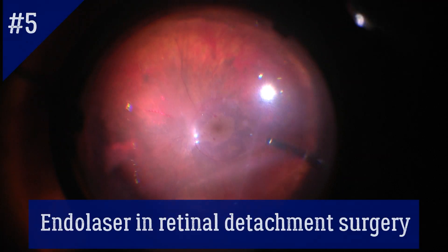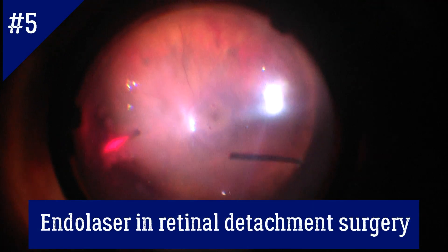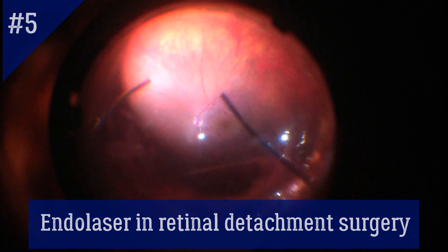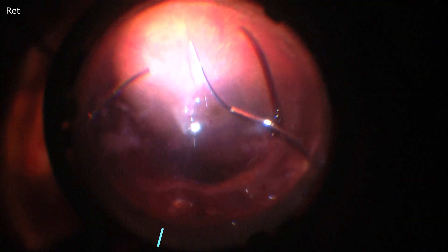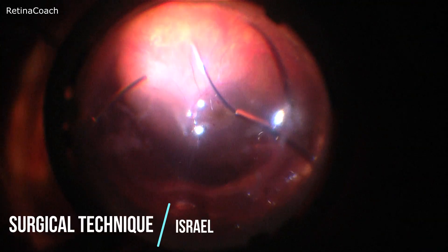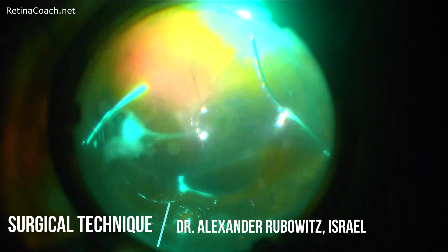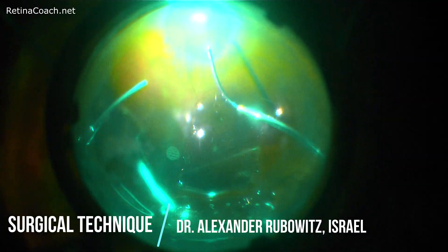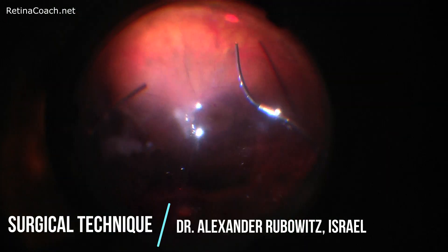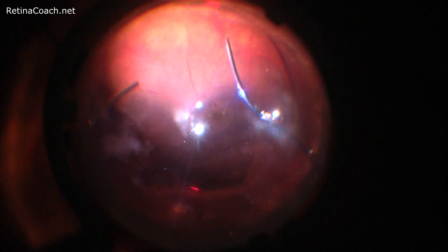This is Anfisa from RetinaCoach, and today I'm going to talk about endolaser in retinal detachment surgery. Endolaser photocoagulation is used to create scars around retinal tears, drainage retinotomy, or for treatment of suspicious areas without any identified breaks.